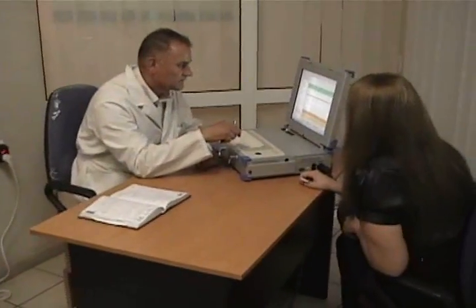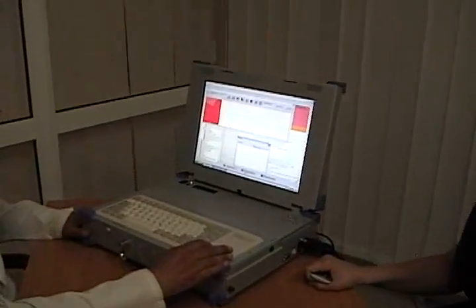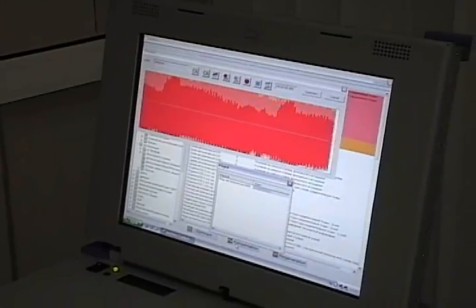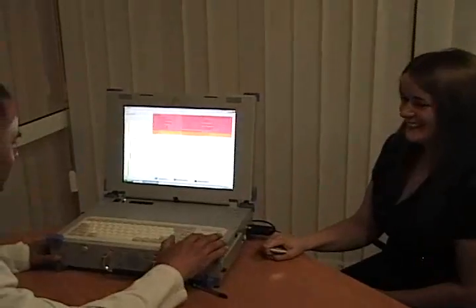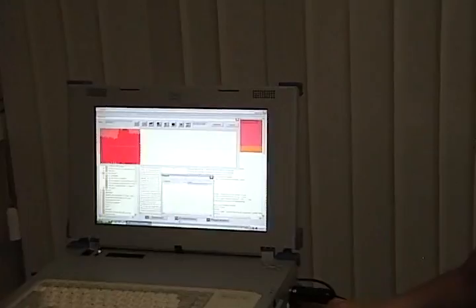CME is also an integration of Western and Eastern traditional and alternative diagnostic techniques and treatments. CME device uses only naturally occurring energy waves of a patient's body. It does not emit any waves of its own, as is the case with ultrasonic, MRI imaging, and computer tomography. CME is designed for use in virtually any conditions and environments. CME Doctor's Assistant and all equipment related to CME was thoroughly tested and has passed certification by many medical and scientific institutions.